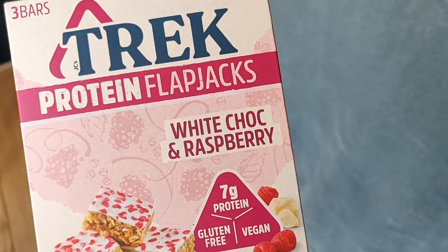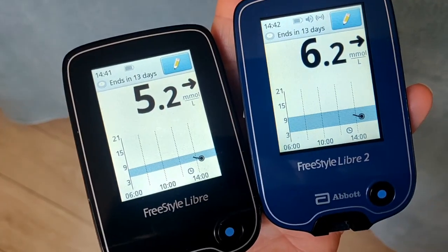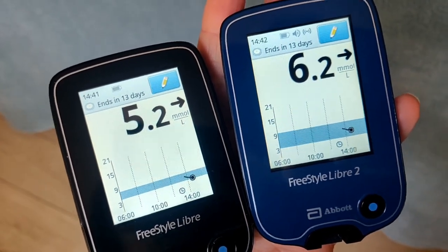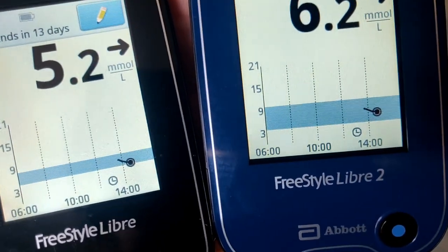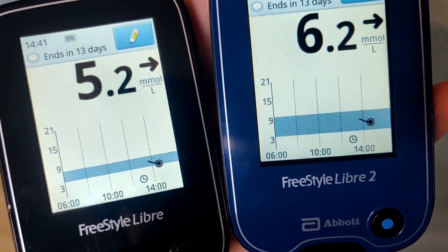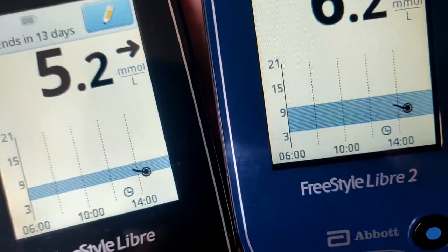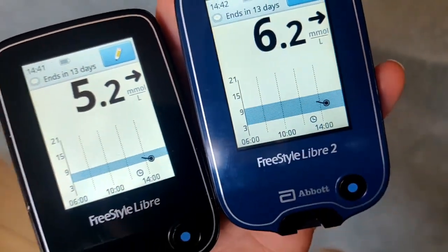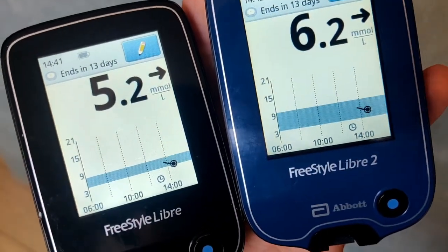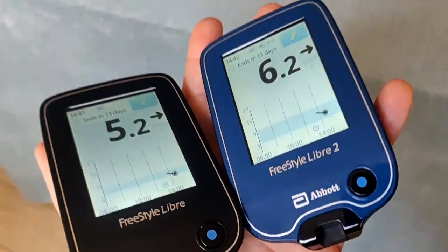Around 3 o'clock I'm having a Trek bar — gluten free and vegan, 20 grams of carbs. Checking blood sugar on both first: Libre 1 says 5.2, Libre 2 says 6.2. One unit difference doesn't really mean much. I did notice my whole graph has disappeared — I think this is because I corrected the time on both monitors. So a tip: if you reset the time, the whole graph for the rest of the day disappears on both. A bit annoying, but the readings are still accurate.